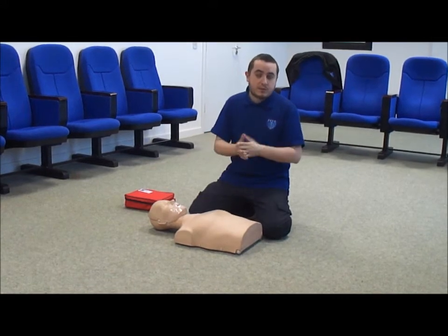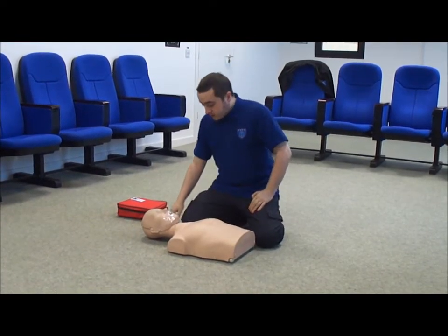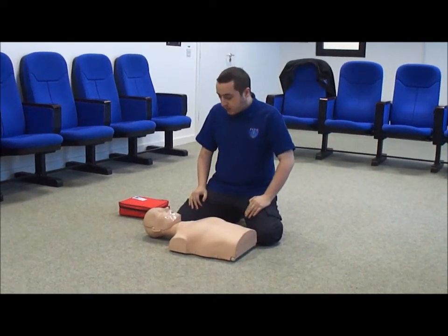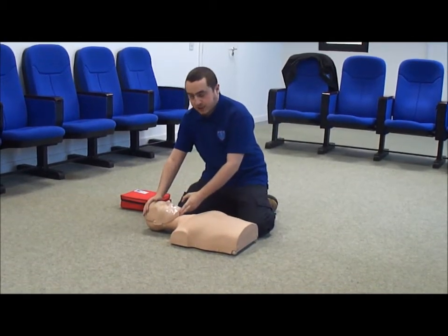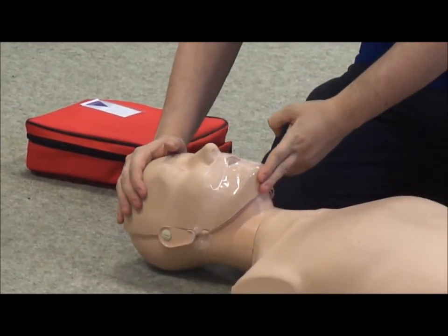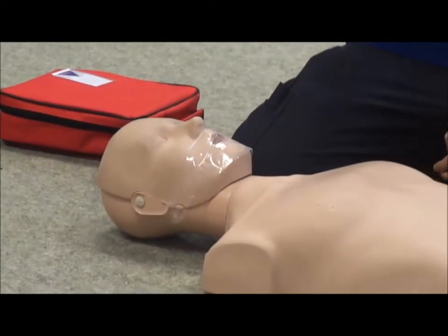But with mobile phones now, we don't have to leave our patient anymore. We can make that call ourselves. The next thing we do, in this circumstance I've sent somebody to do it for me, is open the patient's airway. To open their airway, we do a very simple little move called a head tilt chin lift maneuver. You put your hand on the patient's forehead and two fingers under the bony part of the chin, and we open the airway. We do this specifically to stop any blockages that might be there, particularly the tongue.